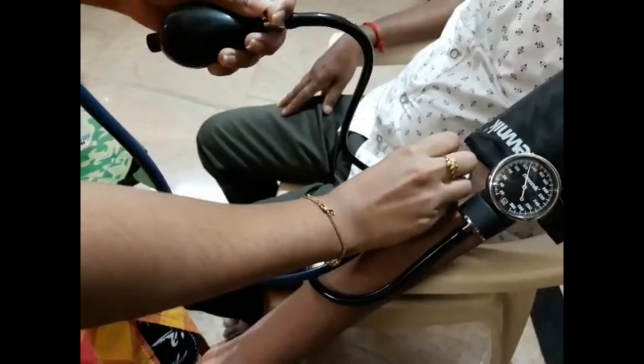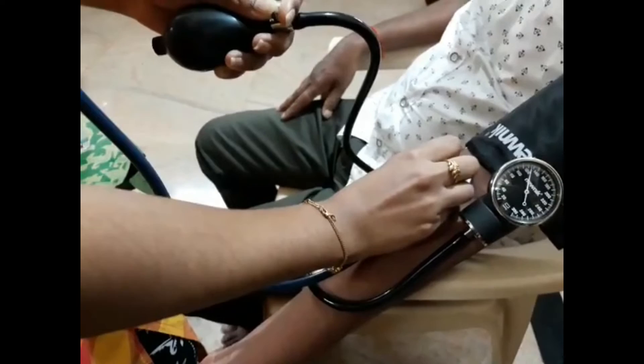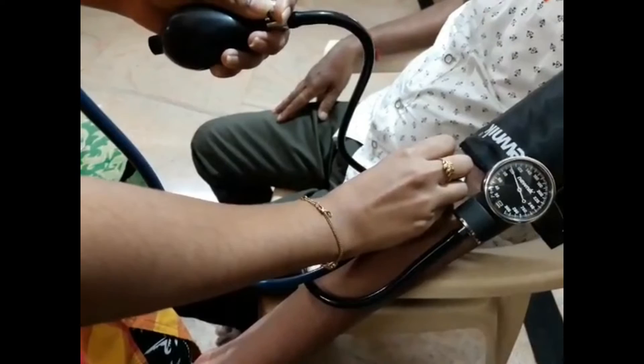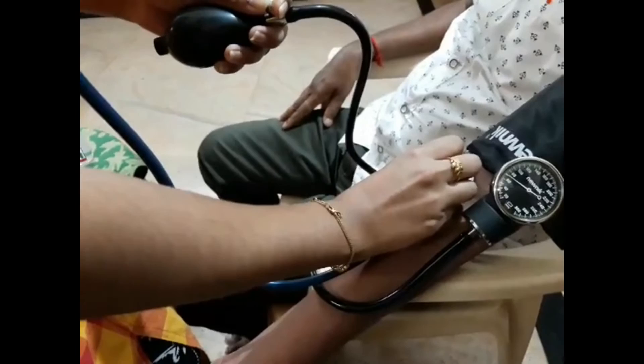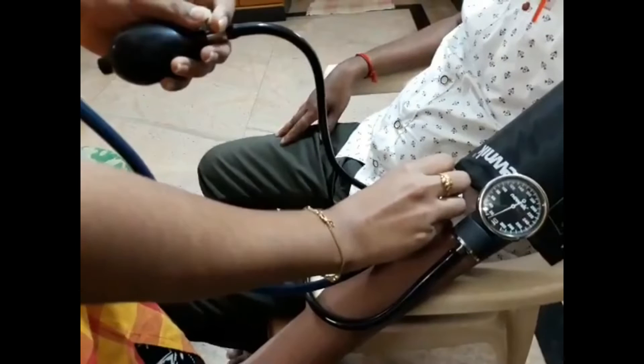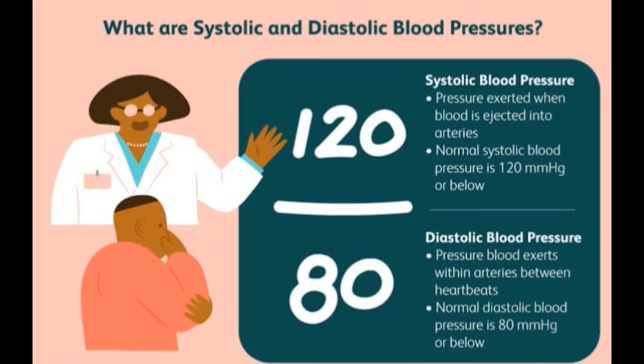Slowly release the valve. At 83 mmHg, I found no sound — that is the diastolic pressure of the patient. Your blood pressure is at the rate of 127 by 83 mmHg, and it is normal.